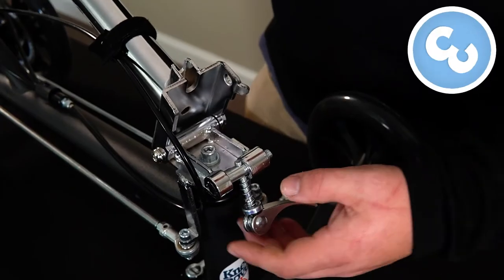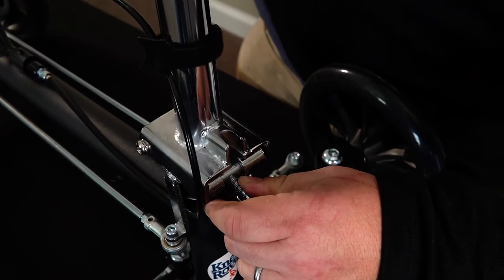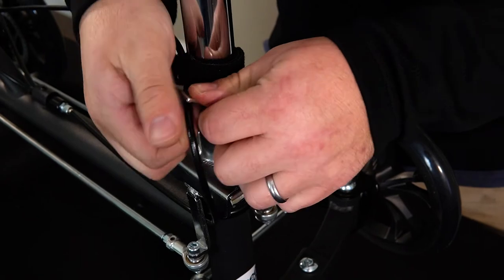Step number three is securing the steering column. We're going to take this quick release lever and pull it over, release it, then take this lever here and clamp it over.